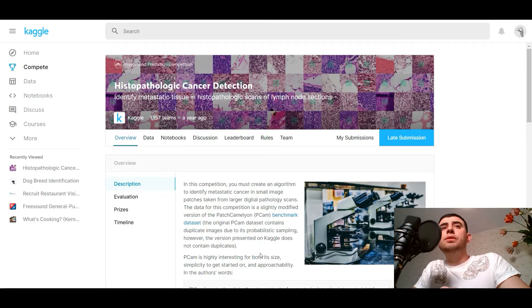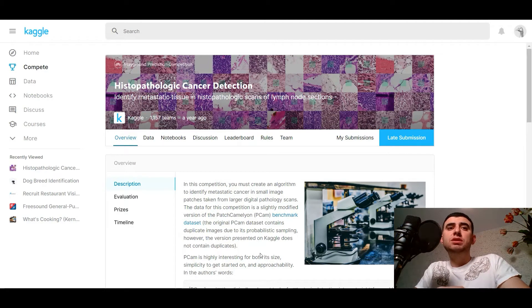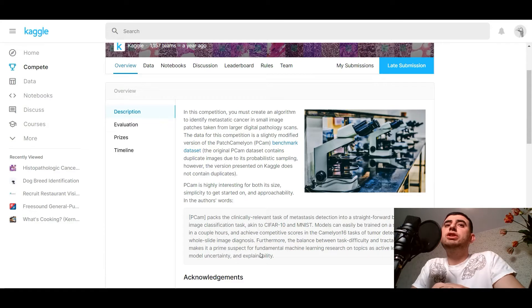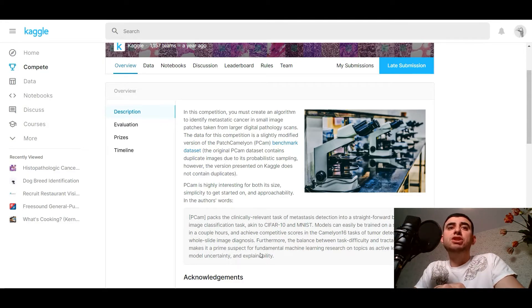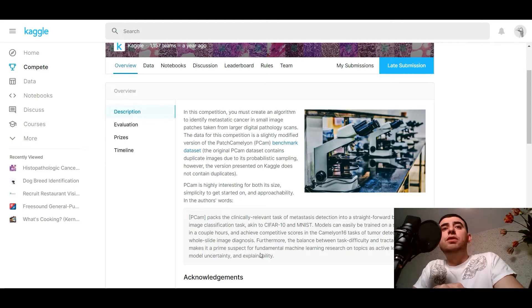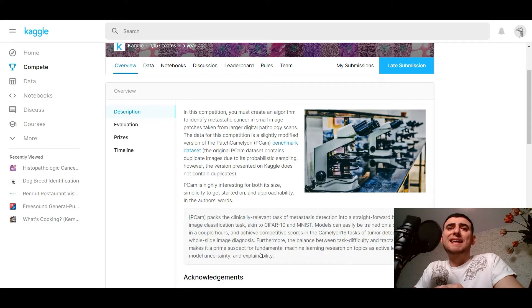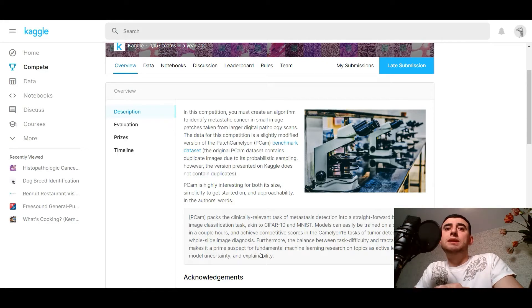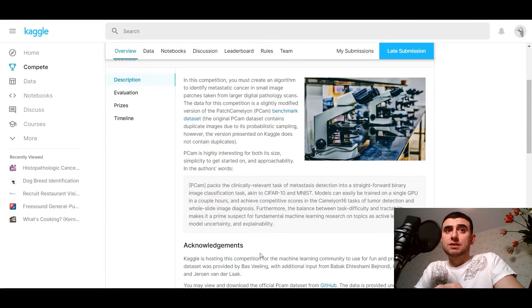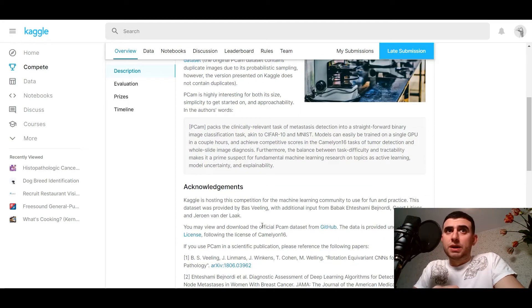First of all, we need to overview the competition, so let's read the description. In this competition you must create an algorithm to identify metastatic cancer in small image patches taken from larger digital pathology scans. The data for this competition is a slightly modified version of the PatchCamelyon benchmark dataset. The original PCAM dataset contains duplicate images due to its probabilistic sampling; however, the version presented on Kaggle doesn't contain duplicates.